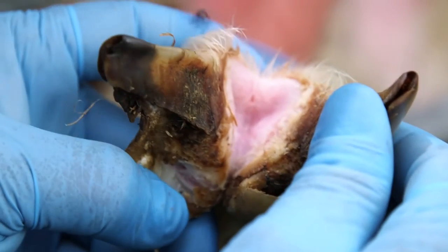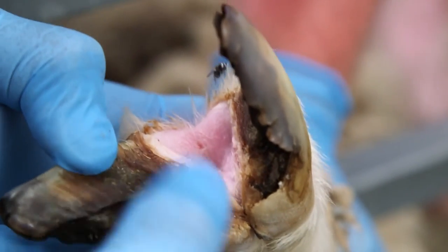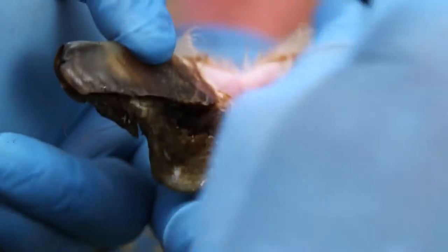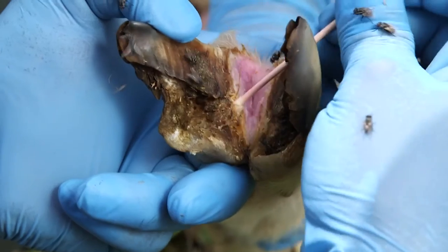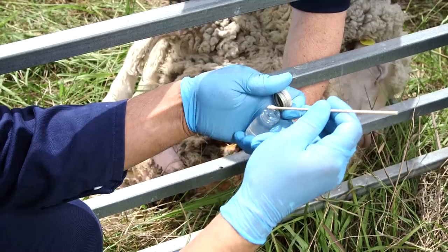We'll now demonstrate how to sample for foot rot. Examine the affected foot and remove debris to expose the interdigital lesion. If necessary, pare back the hoof to expose any under-run areas. Using a sterile swab, scrape material from the active foot rot lesion. The swab should be inserted deep into the lesion to avoid surface contaminants.